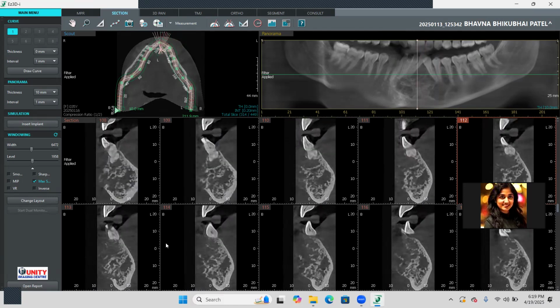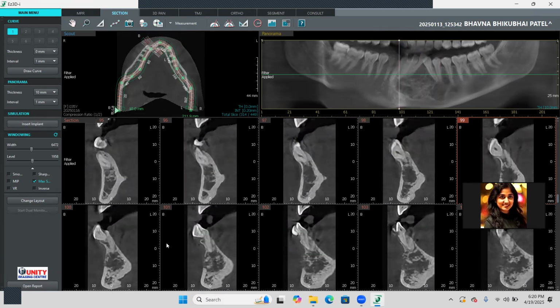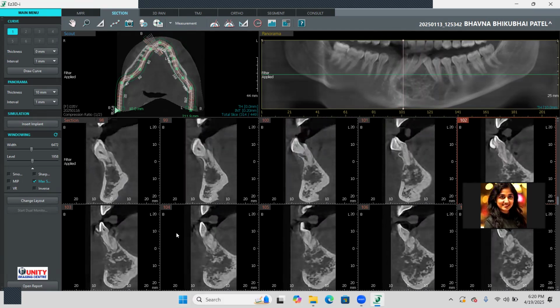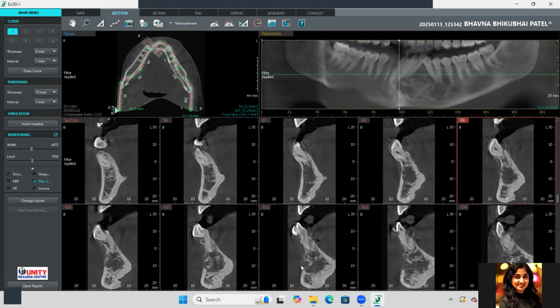So CGCG. Okay. We cannot confirm a diagnosis based on CBCT, but at least we get the prominent features which tell us, like the small locules which are formed, the curvature of the trabecula because of the pushing of the contents.